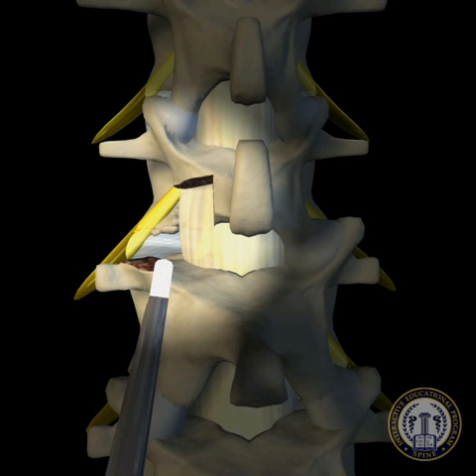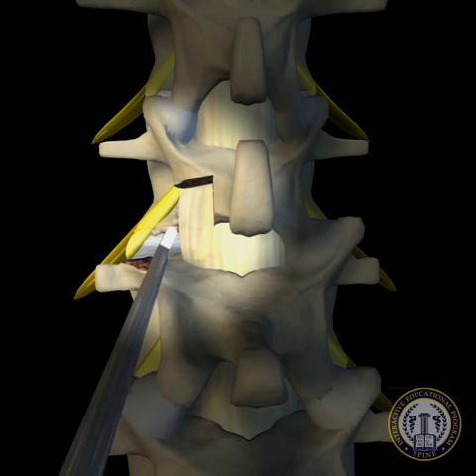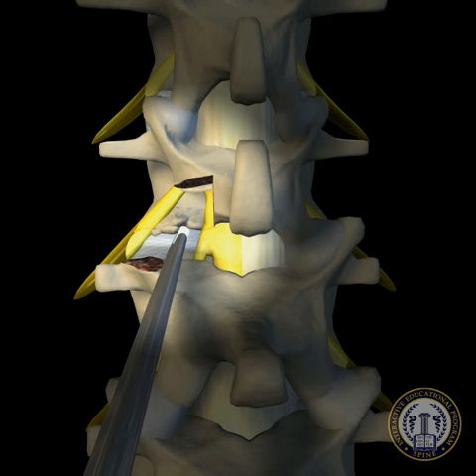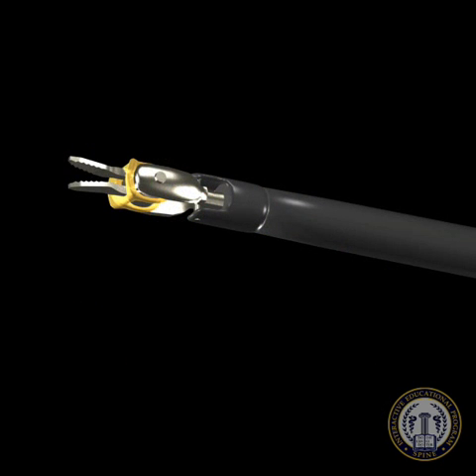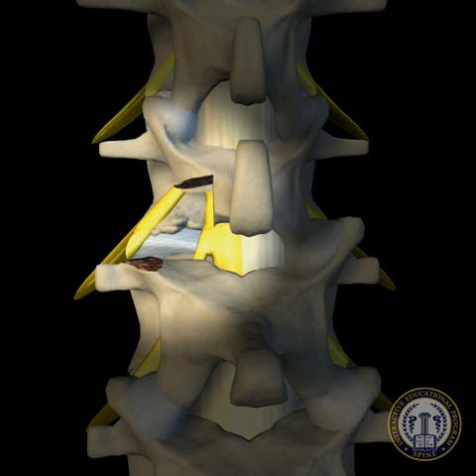The ligamentum flavum covering is now removed in a stepwise fashion using Kerrison rongeurs to expose the traversing and exiting nerve roots. Epidural bleeding frequently occurs during this step and may be controlled using bipolar cautery and thrombin-soaked gel foam. Though it is unnecessary to expose the entire exiting nerve root, it is important to be aware of both the root's location underneath the superior pedicle and the amount of space between the medial edge of the exiting nerve root and the lateral margin of the traversing root.